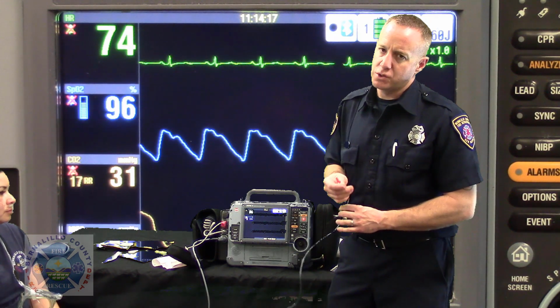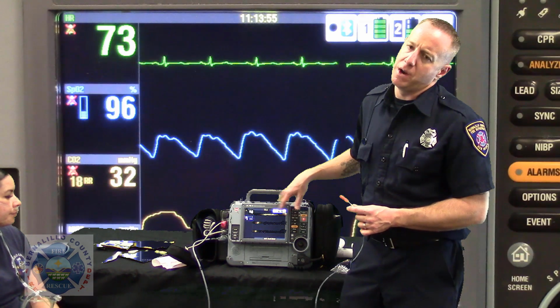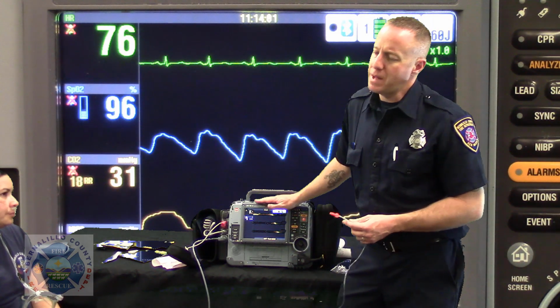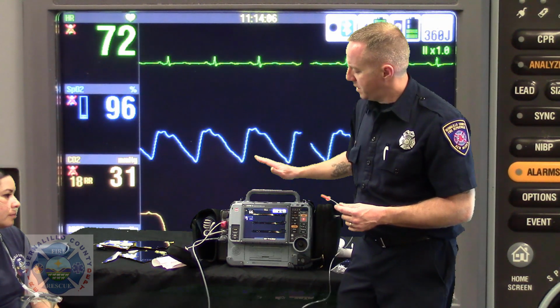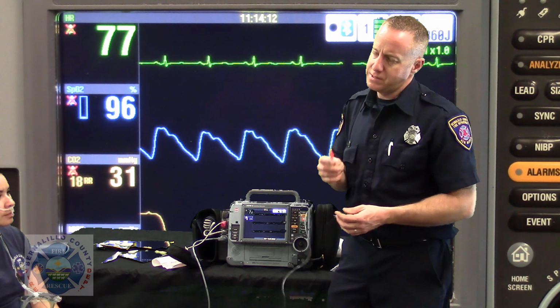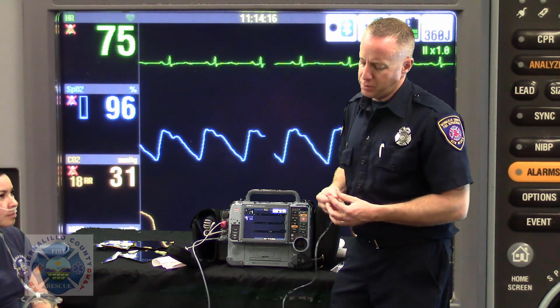And if you were to unscrew this, the only way to turn that module off would be to cycle the monitor off. So once you commit to end-tidal monitoring on this patient, it's best to continue that process until you're ready to turn the patient over to another device, or you want to turn this off and turn it back on as a new file, but then you're going to have to enter all your data again. So this is a commitment. Once you start sampling somebody, you're going to monitor it from the moment you plug this in, so keep that in mind.